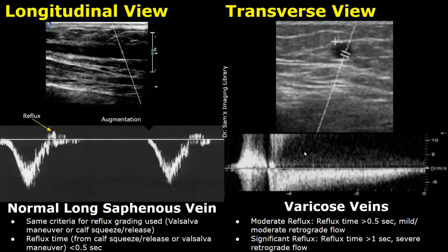However, in varicose veins we can get a large amount of reflux, and you can see a large waveform of retrograde flow. If this reflux time is more than 0.5 seconds, it is considered moderate reflux, and if this retrograde flow duration is more than one second, it is considered severe retrograde flow. The same criteria for reflux grading is used whether it is done by Valsalva maneuver or through augmentation.